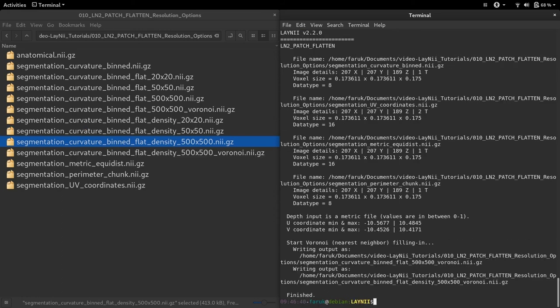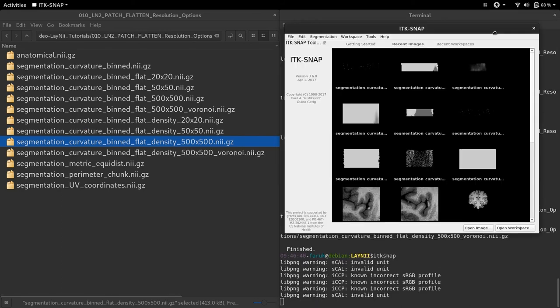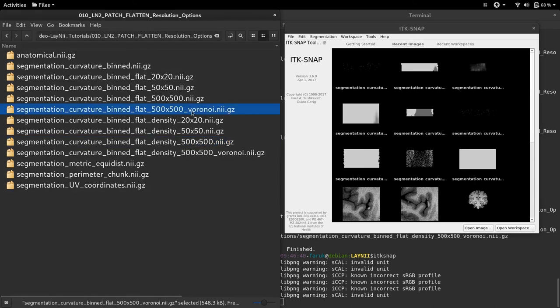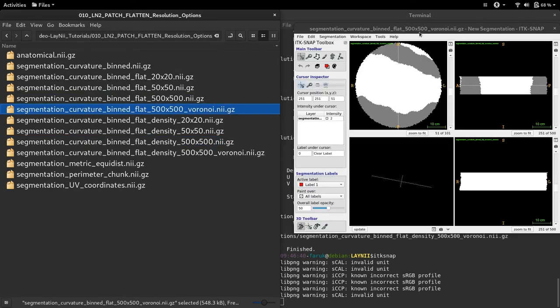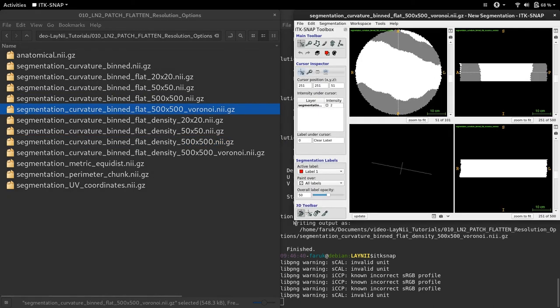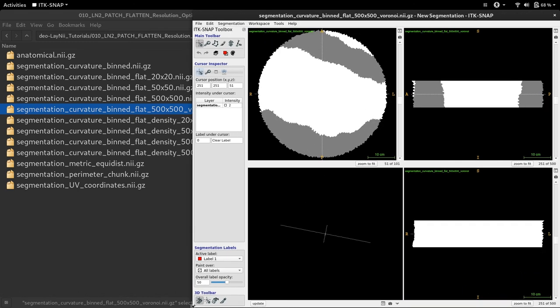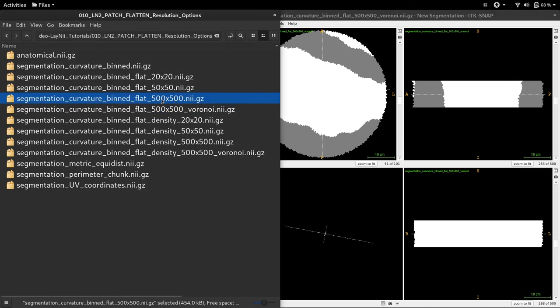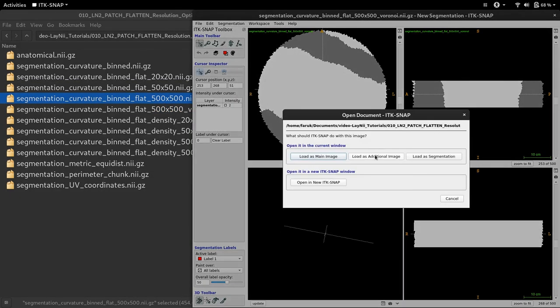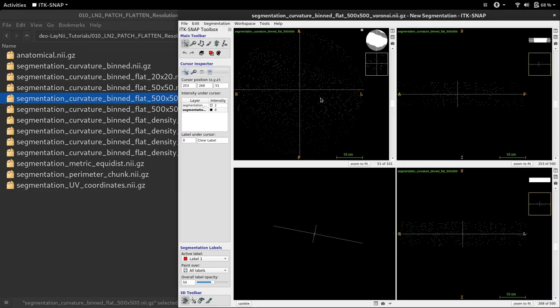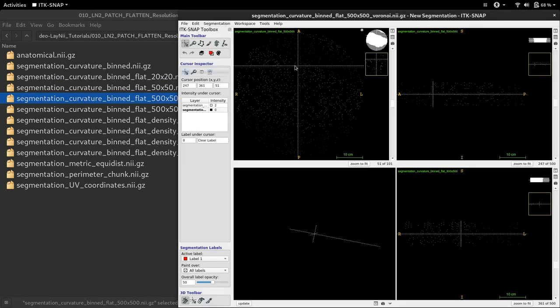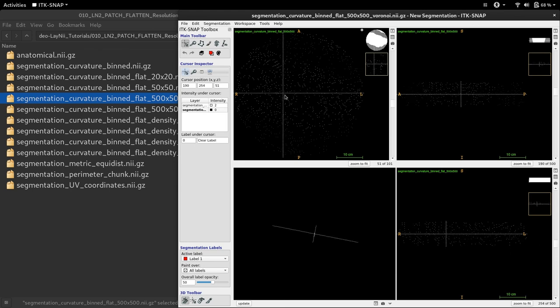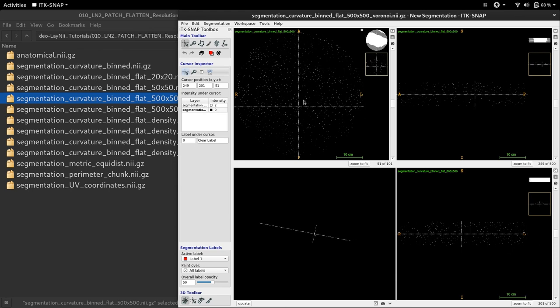It's finished. Let's inspect the results. Now you can see that I have an extra output called Voronoi. And if I load it, you'll see that now the empty bins are filled in with an interpolation. Now let's compare it to the old version where we see the voxels sparse.